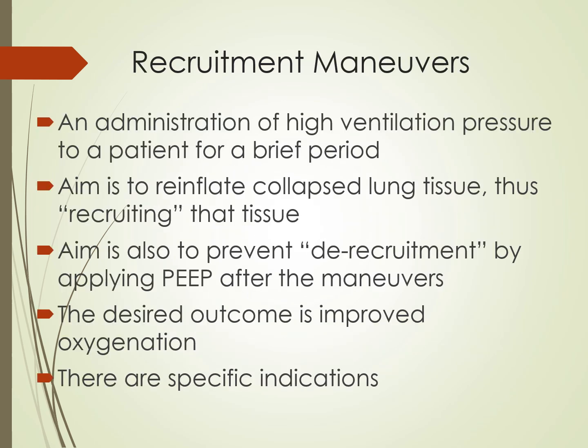Let's talk about recruitment maneuvers. I am sure you all have heard of it, but not many respiratory therapists actually do it. I don't know why they don't do it, because the evidence is strong to support it. Basically, it's an administration of high ventilatory pressure to a patient for a brief period. For example, you will use a high PEEP of 40 for 40 seconds, or you would use a high inspiratory hold with a peak pressure of 40 for 40 seconds.